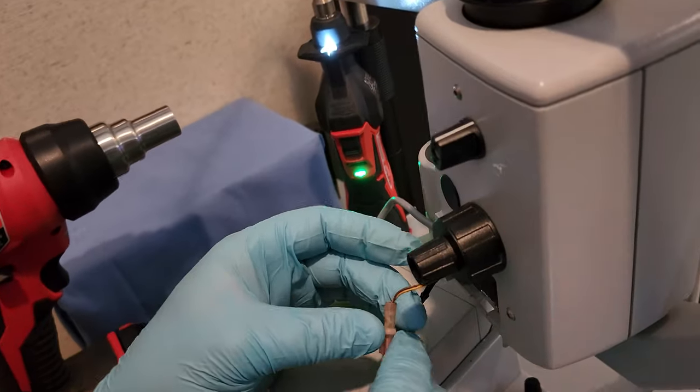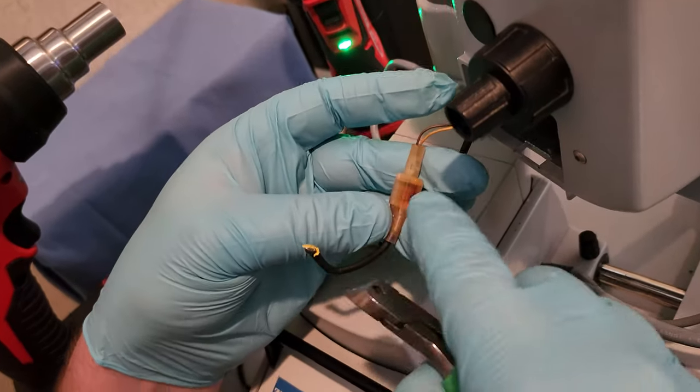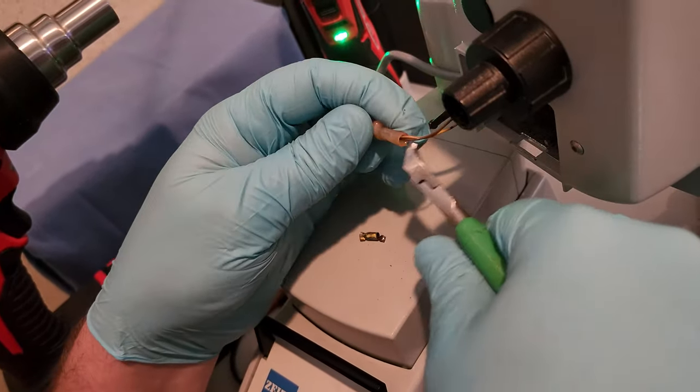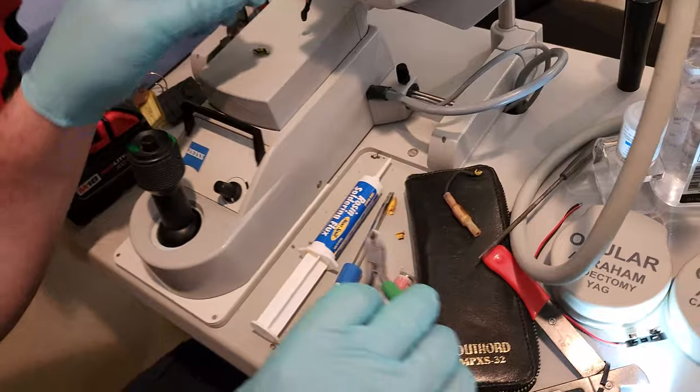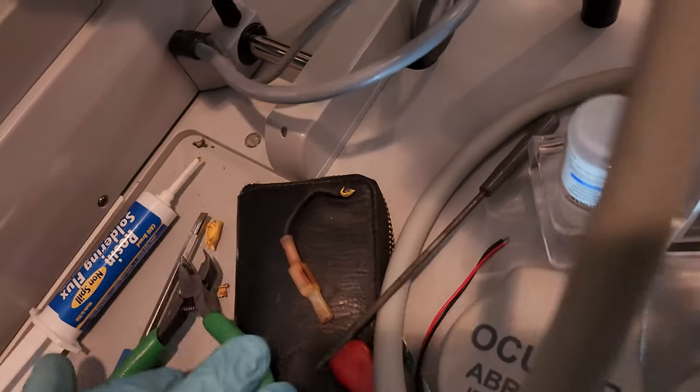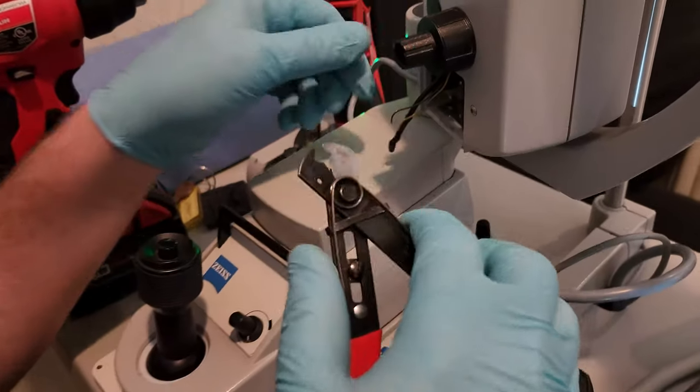So now we gotta prep these wires. See that this has created hot spots and other garbage because it wasn't the right tool for the job. So I'm gonna cut out all the old garbage. Got to strip the very ends of these back just a little bit.